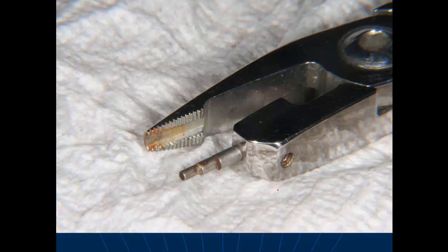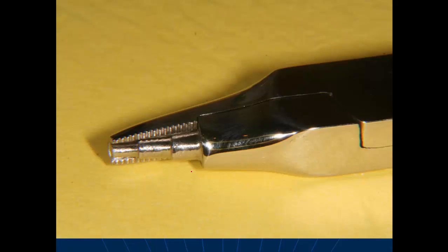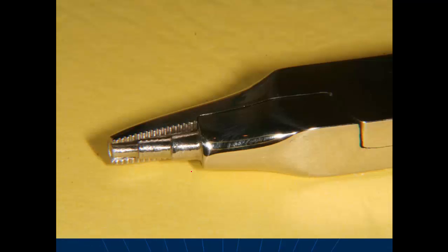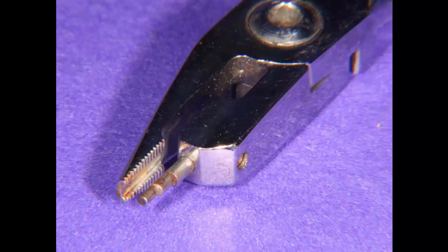Now this is the tweed loop plier, a little closer view of it. Most of the time we bend the loops that we form here. If you're making a real small one, you make it on this tip of it, and it holds the wire real good there while you bend it. Let me go back and erase that. Now, the other plier will bend the loops too, very good. But if it ever bends away from this, that's where you can't hold it tight down here. It kind of gives you a little problem making the loops. And if you break that tip off, you just have to get another plier.